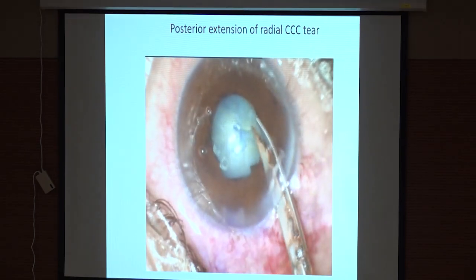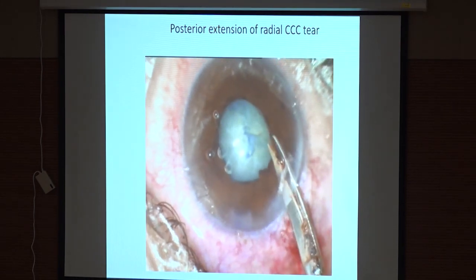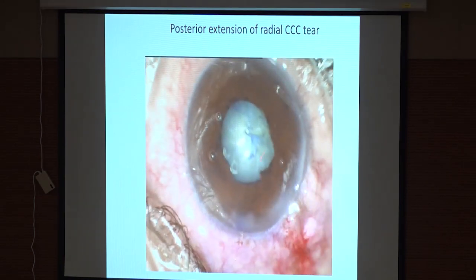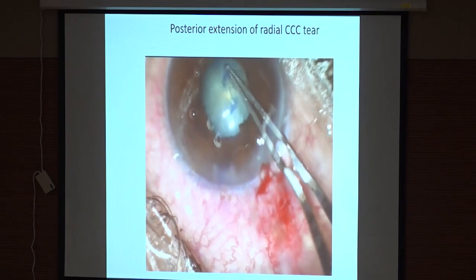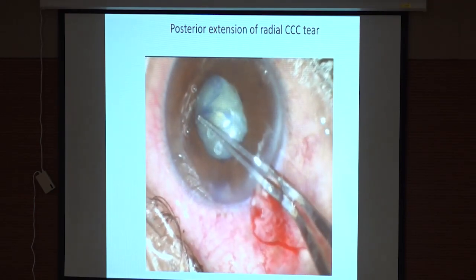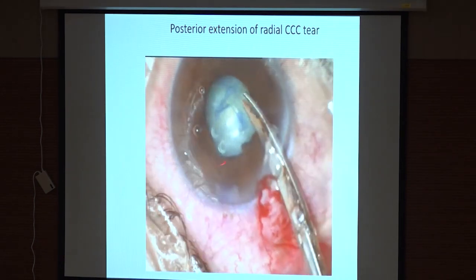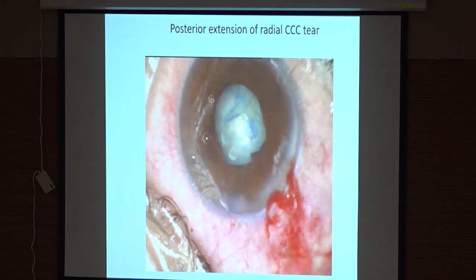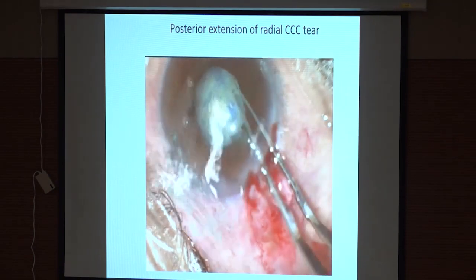I don't do these things any longer. I would do a very small CCC, a 2-stage CCC in intumescent cataracts these days, and I've also stopped cutting the CCC margin and then completing the CCC after giving a small nick, because you must remember you have converted the CCC to almost 310, 320 degrees, but you still have a radial extension there.